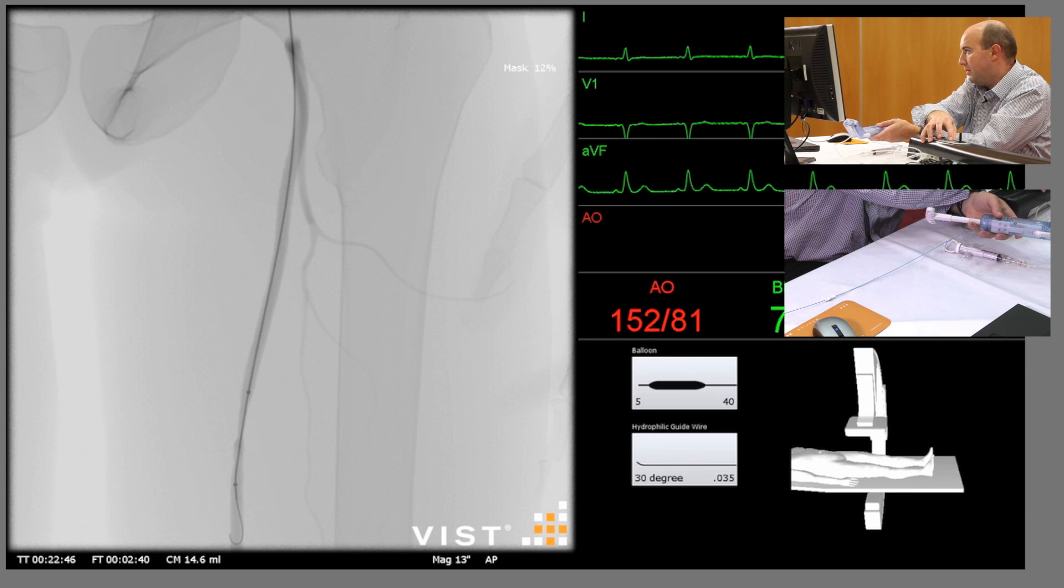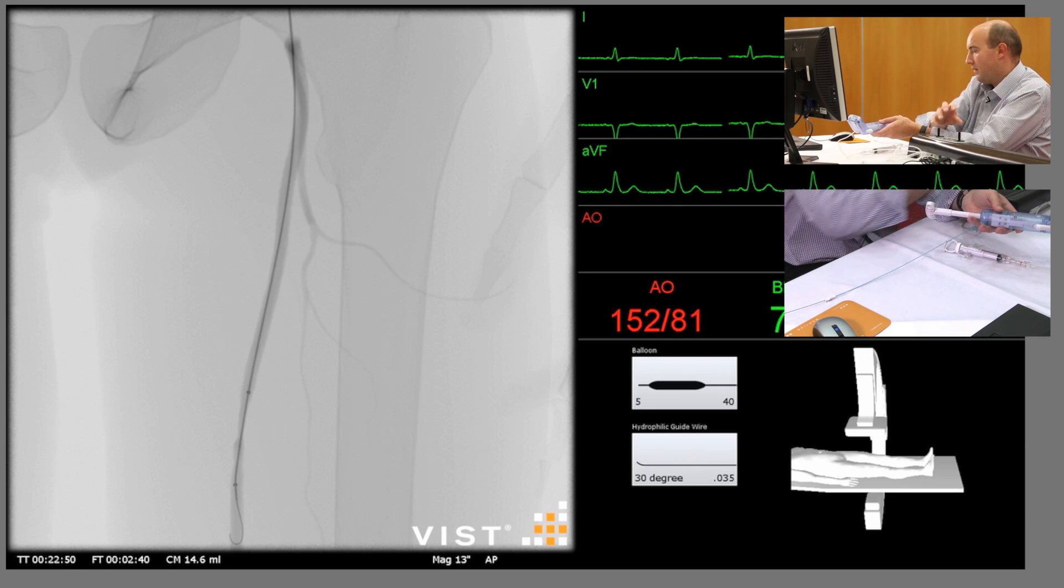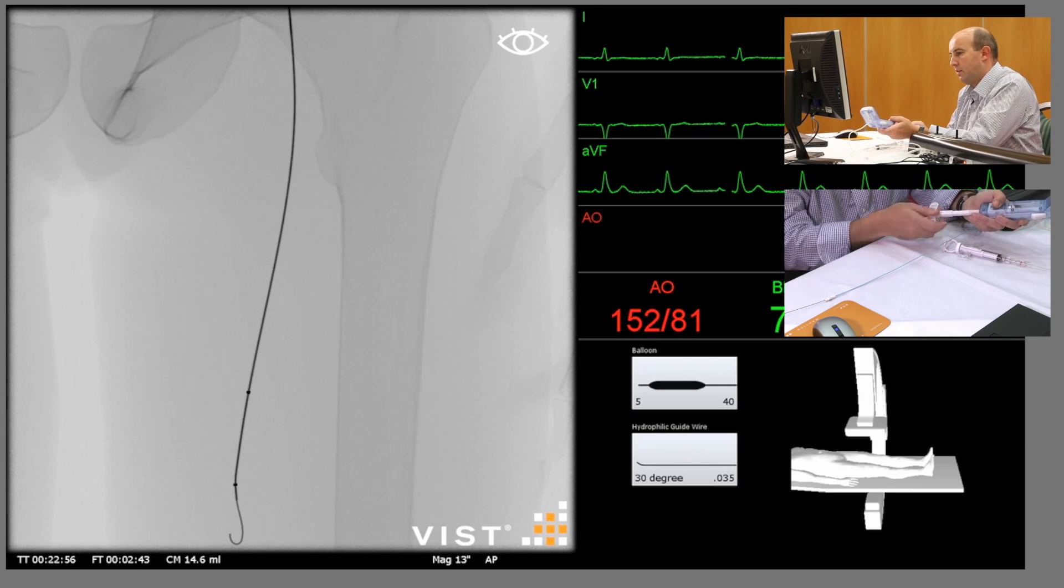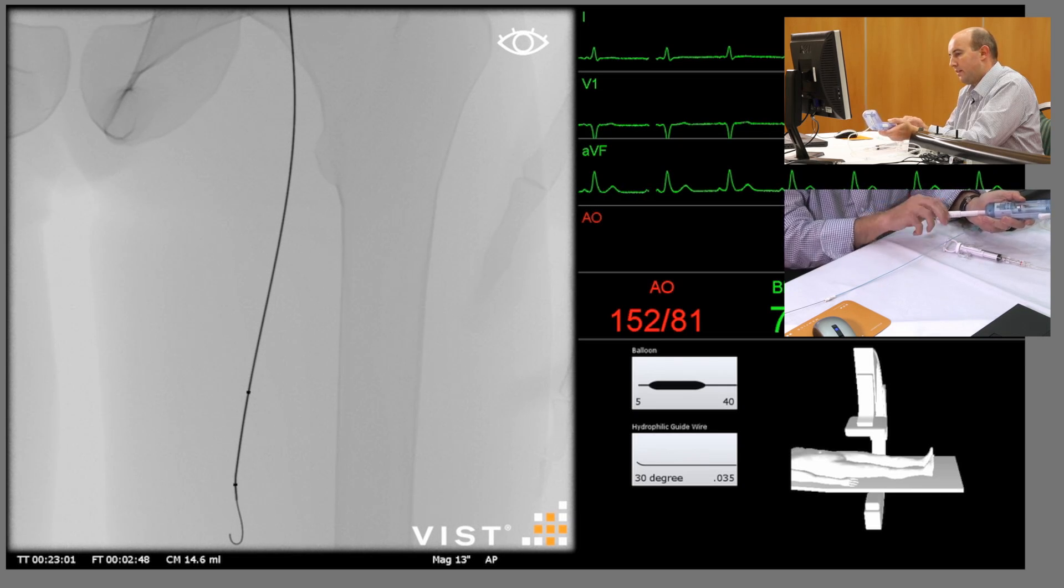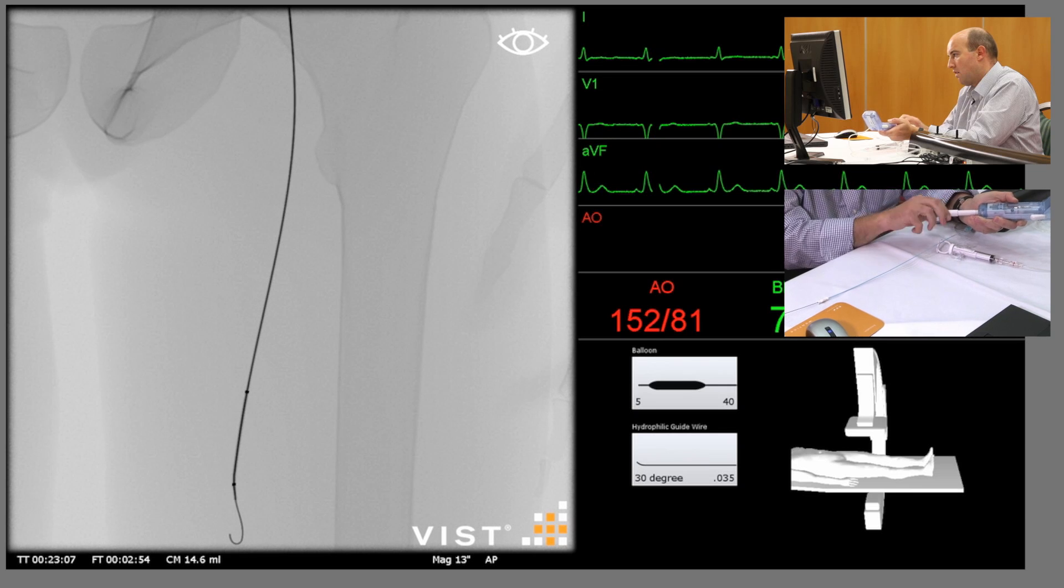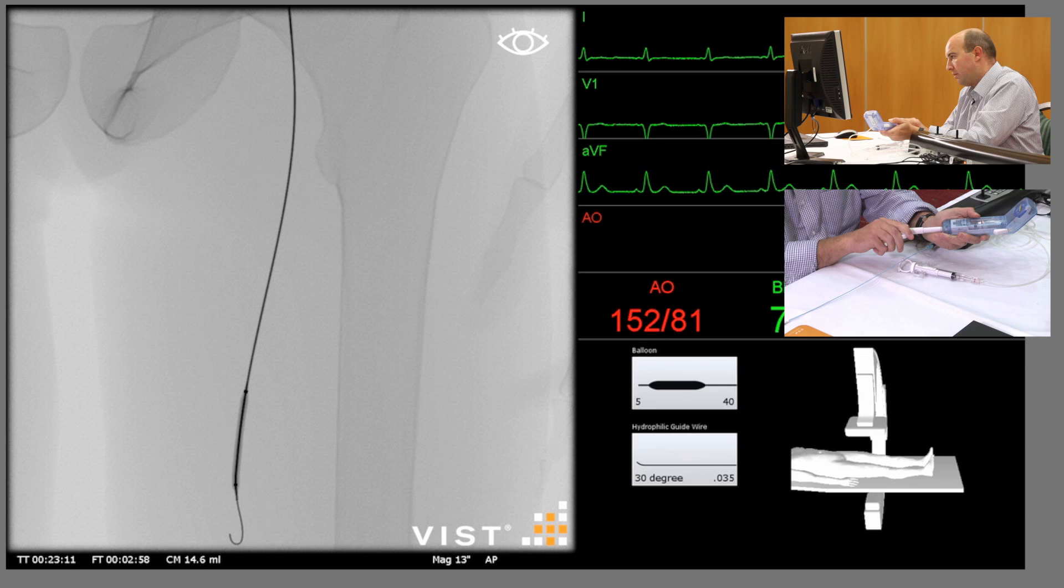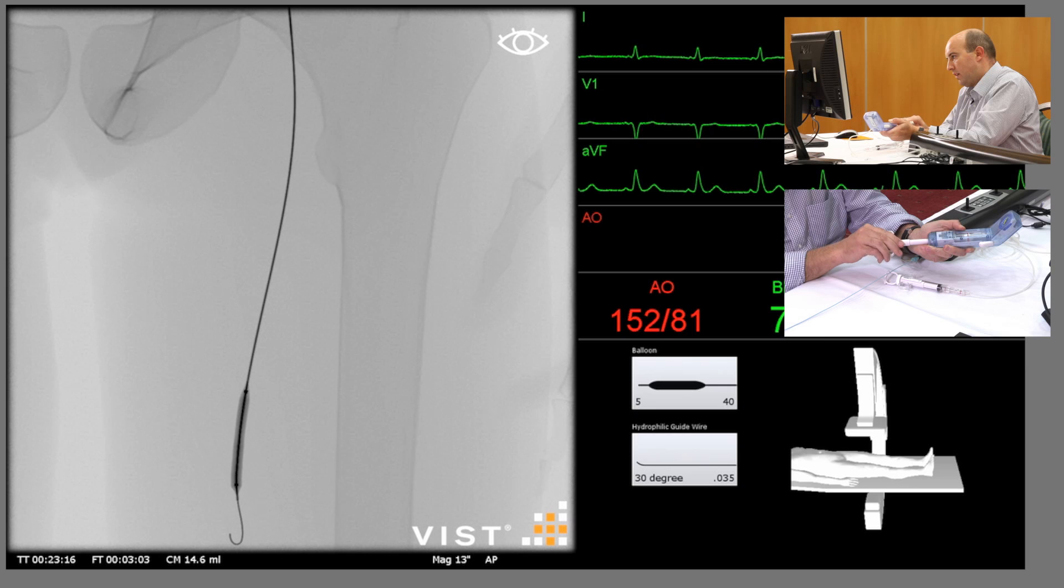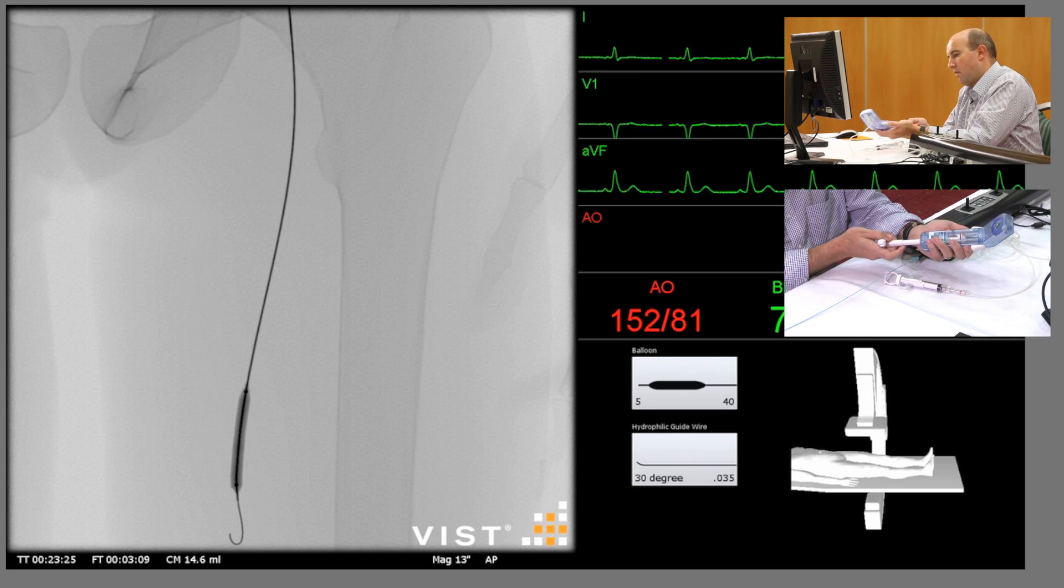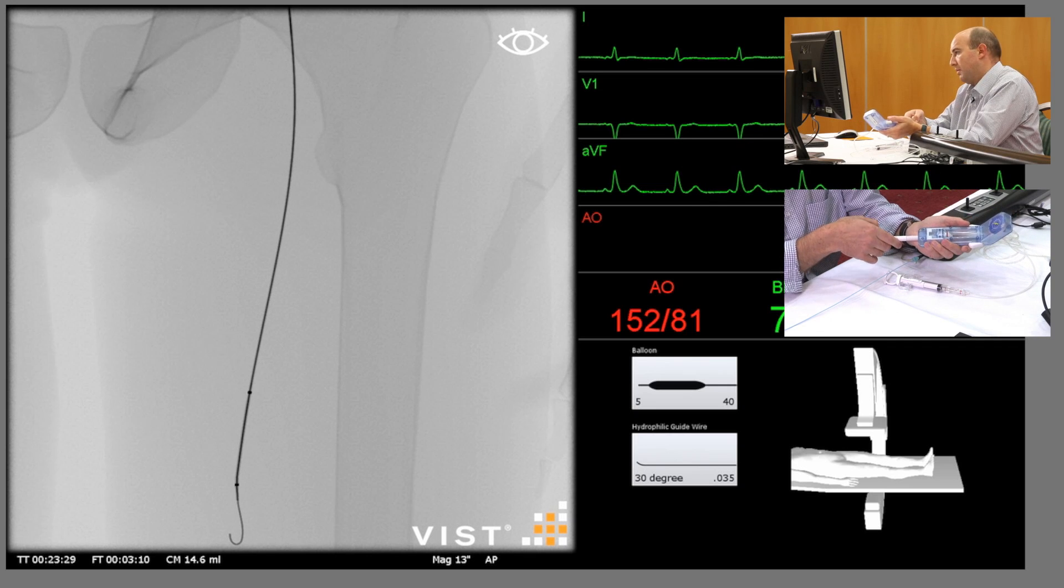Once we're in that position, I would tend to take the mask right off. We know we're in the right position and just screen, inflating the balloon. We know that the pressures for this balloon are between eight and ten atmospheres. Slowly getting there. Balloon's beginning to inflate now. In reality I would tend to leave this up for between 20 and 30 seconds.